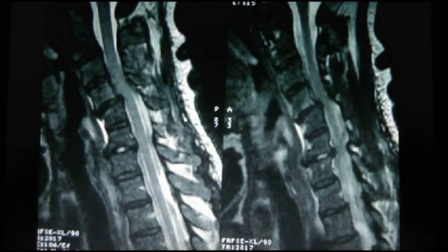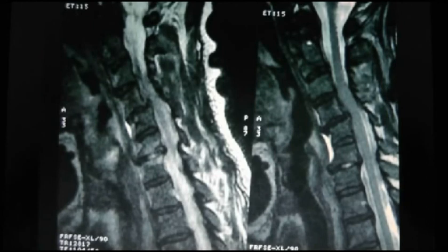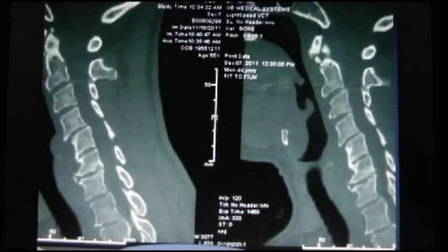So what do you see here on the sagittal? So here's a T2 weighted MRI with the CSF being bright, and at the 4-5 level, you can see the cord impingement due to the anterior listhesis of 4 on 5. The cord margins are indistinct, especially in the left image, but there's a little bit of increased signal at the topmost area. The signal's increased, again indicative of more acuity to the disease, that the body is more acutely reacting to the edema in the cord. Okay.